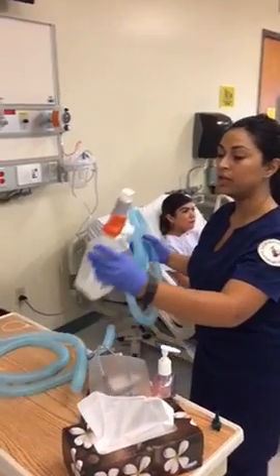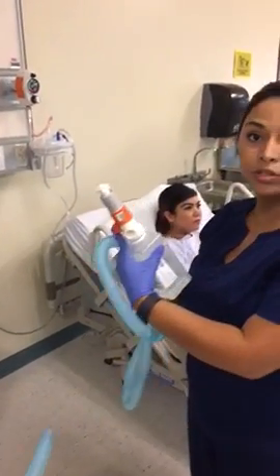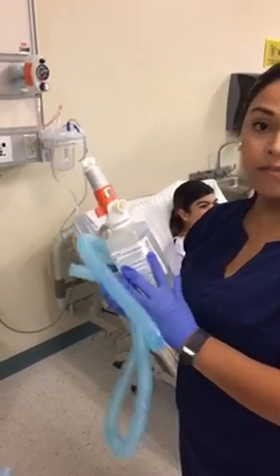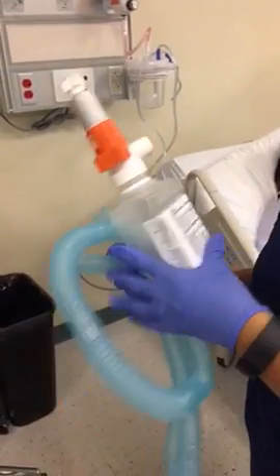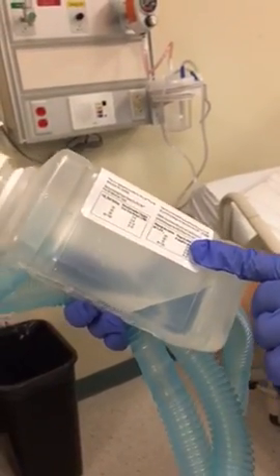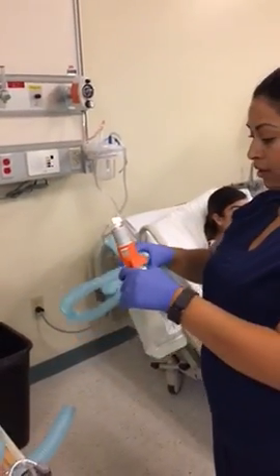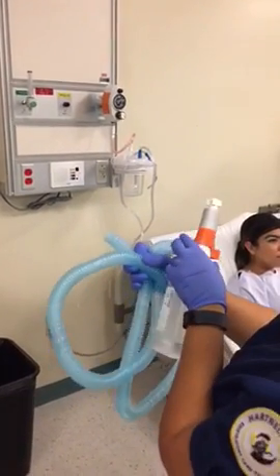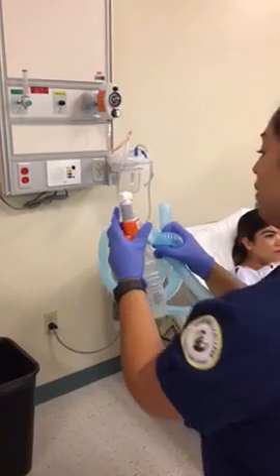So I'm going to set it according to the doctor's orders. He wanted it at 28%, so that would be at 5 liters. There's also a little chart here that you can look at if you ever need to refer to it. Okay, and it's at 28%. Great.